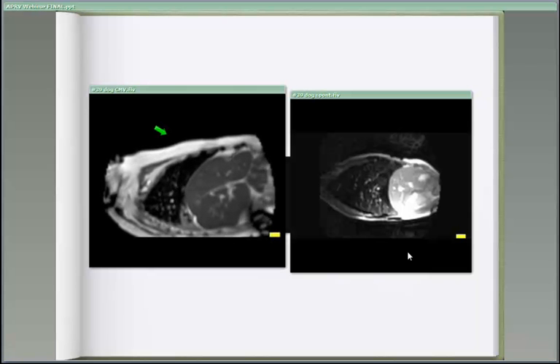Of course, our chest moves in multiple different directions. And you can see the liver is very big and actually encroaching into the thoracic cavity, which is why the abdomen is such a critical part of ventilation. In fact, when you are ventilating a patient, you're actually pushing the abdomen away. So the bigger the abdomen, the more pressure you have in the abdomen, the more likely you are to need higher pressure. Now here's CPAP breathing in comparison.